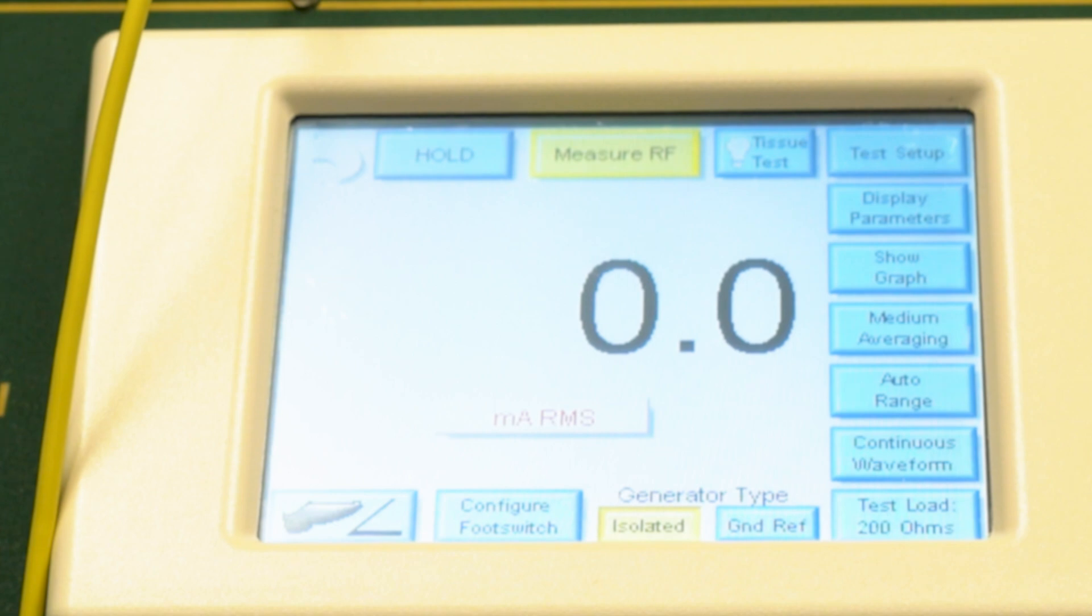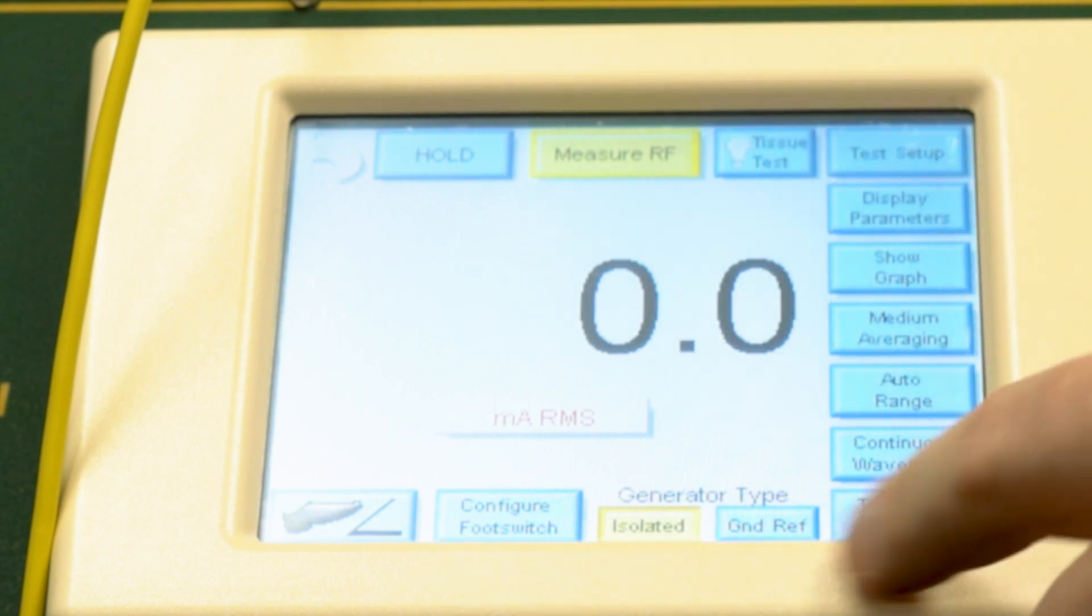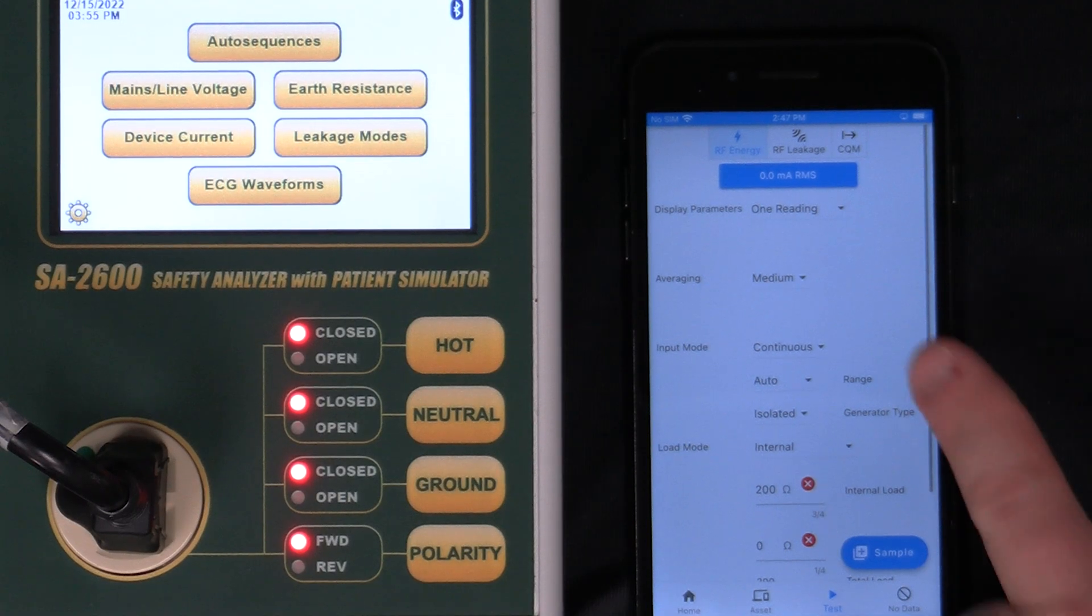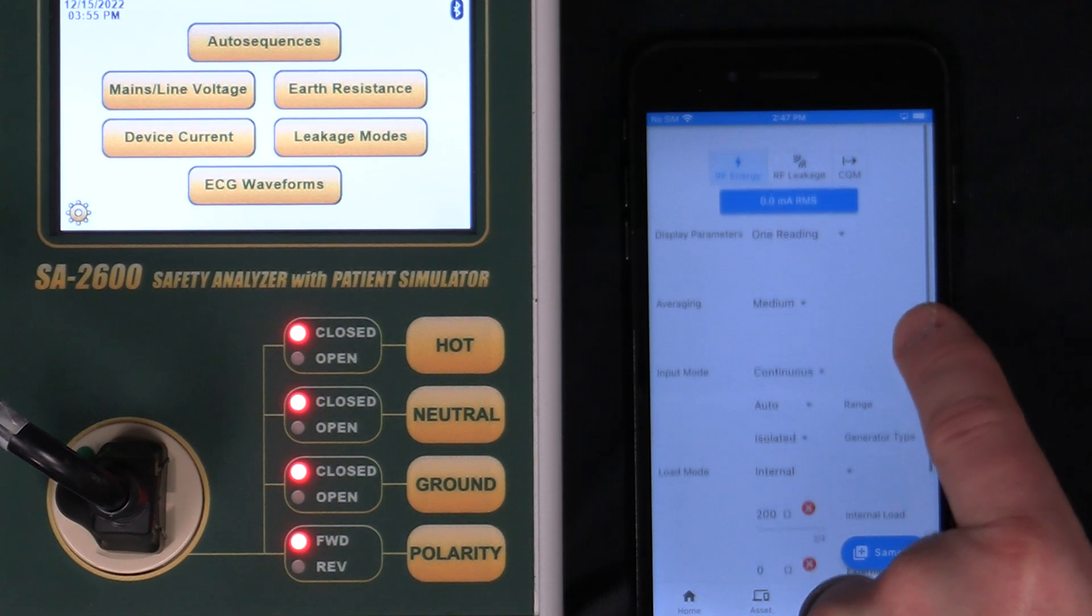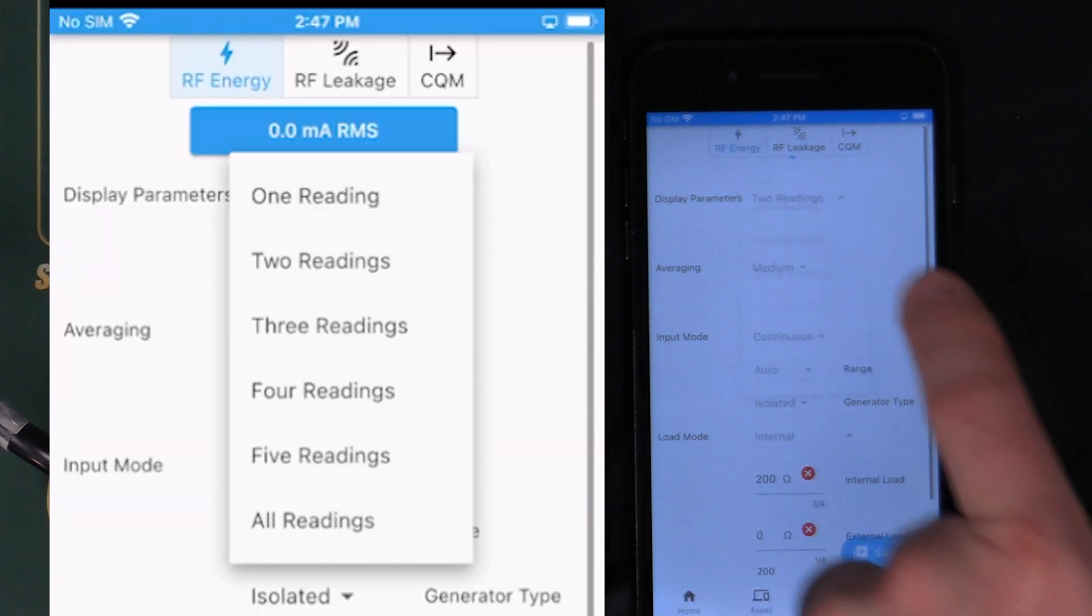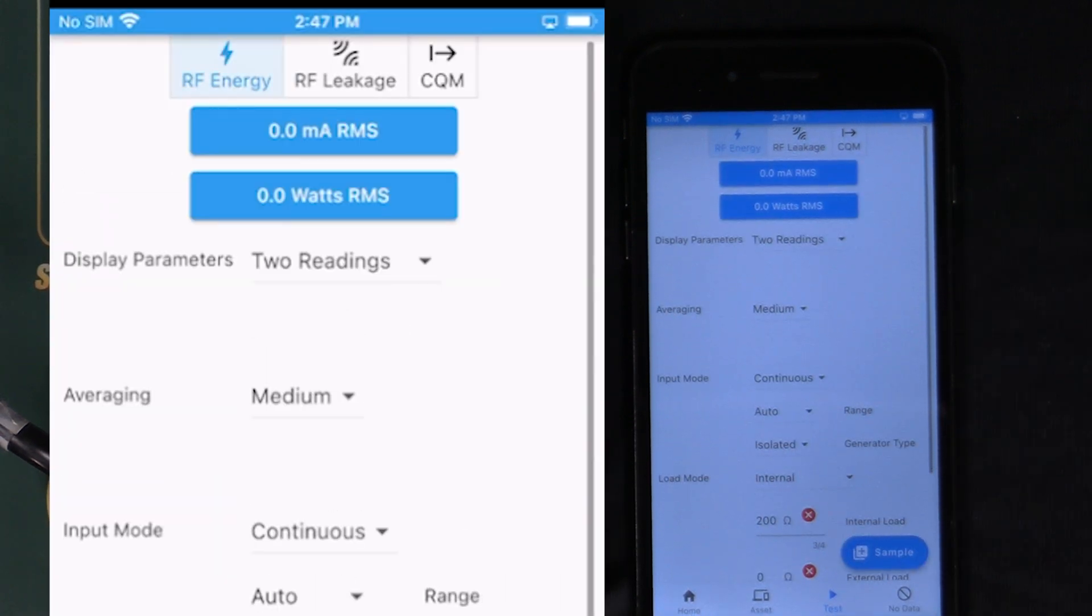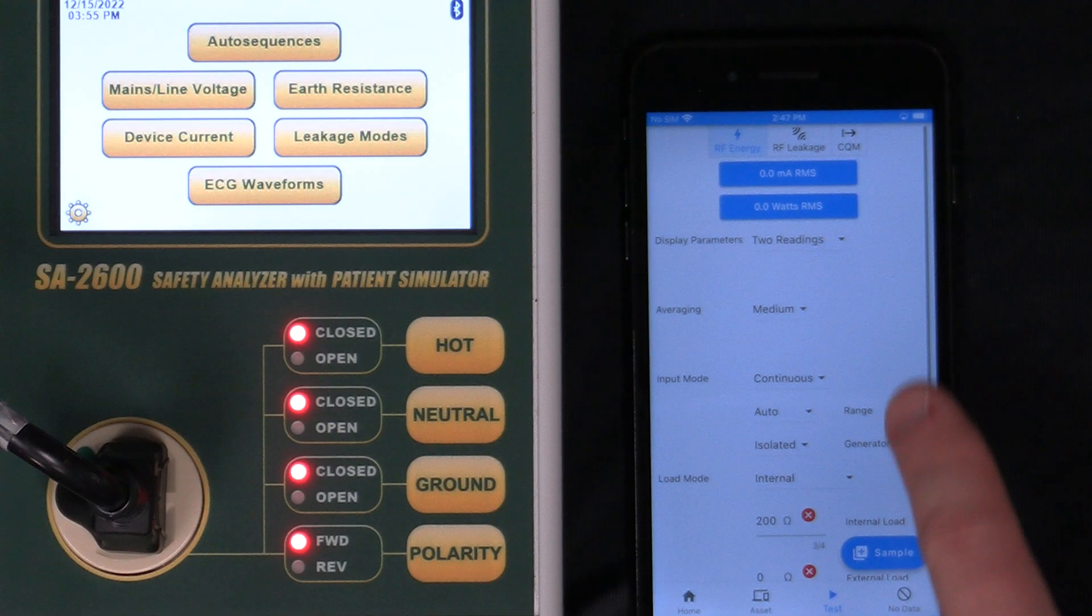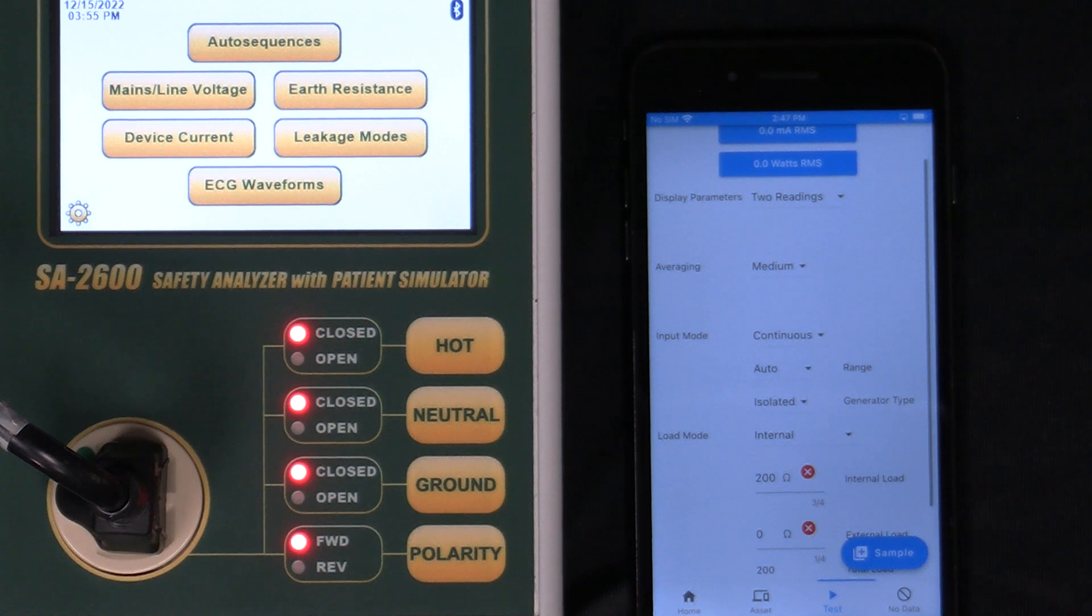We've got a lot of functions on the screen of the ESU 2400. All of these functions can be configured using MyBC Mobile. We see on the screen here we've got one reading. We could select either two readings or more and the screen of the ESU 2400 will adjust to match what we have selected on MyBC Mobile.